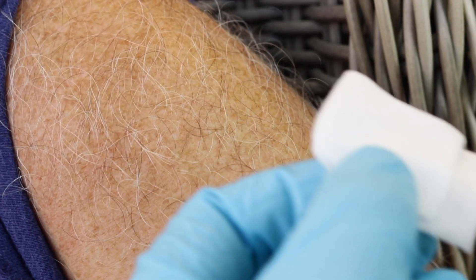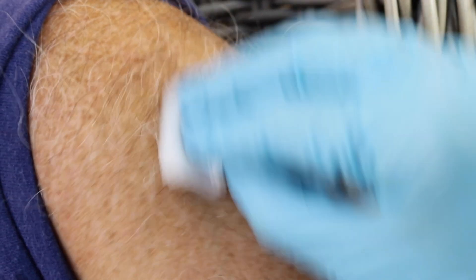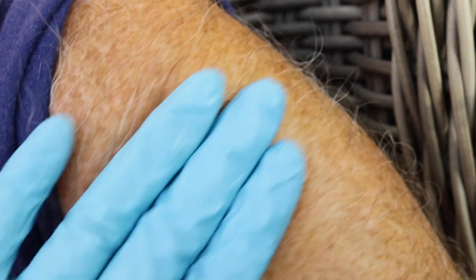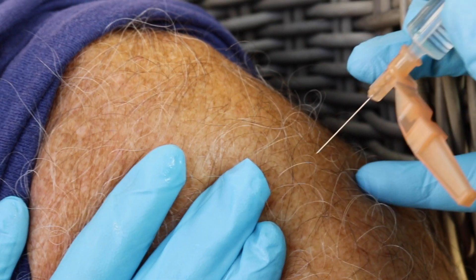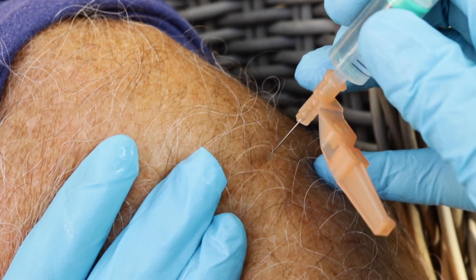Use the Z-Track method to seal the medication in the muscle. This method prevents the treatment from leaking out by making a bend in the track created by the needle. Gently but firmly pull the skin away from the injection site with your non-dominant hand.